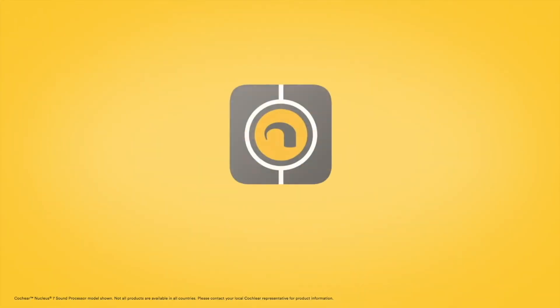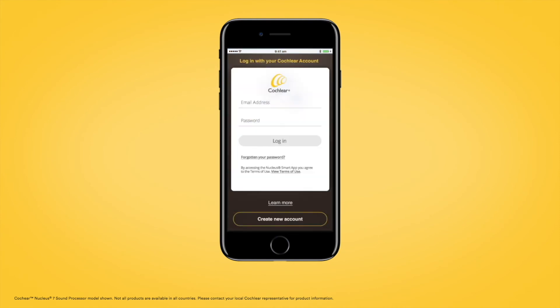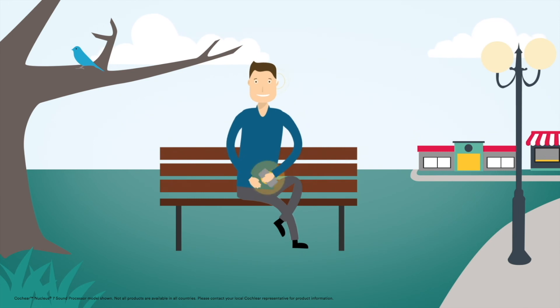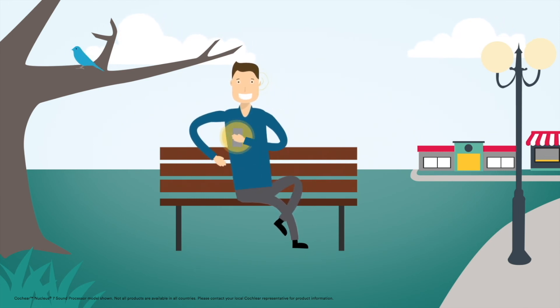If you have not done so already, download the Nucleus Smart App from the Apple App Store. Once downloaded, open the app and log in using your Cochlear account details. When you have signed in, your processor will automatically be recognised by the app.